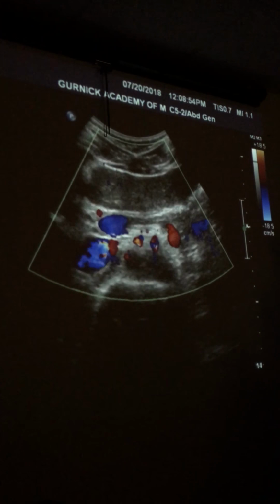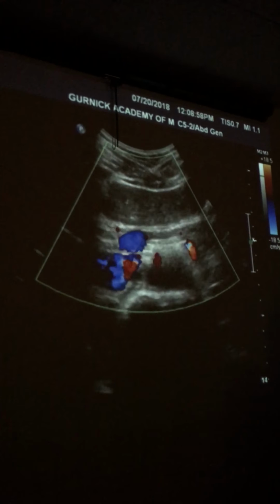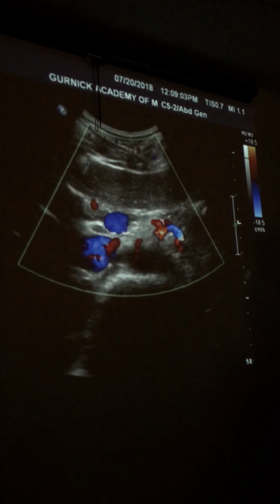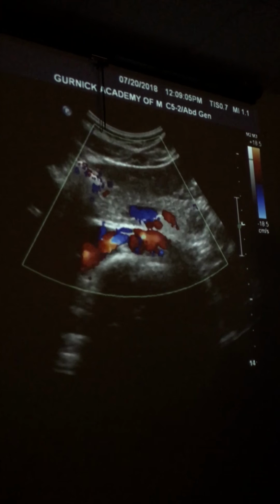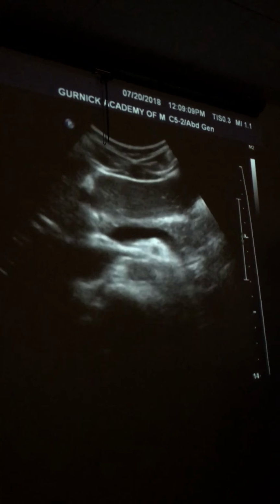Yeah, you can find it. If you can find it like that, go for it. It's all acceptable. It's just this is the easiest way that I found that I can consistently do time and time again, just by my landmarks. Right, on the same plane. She's not following from where it comes in, but yeah, I see what you're saying.